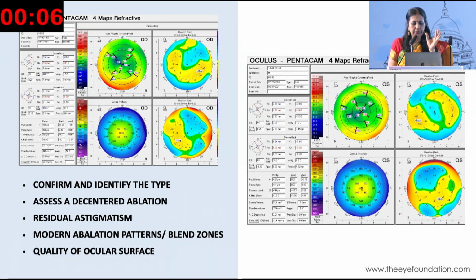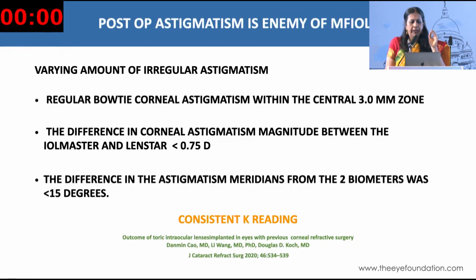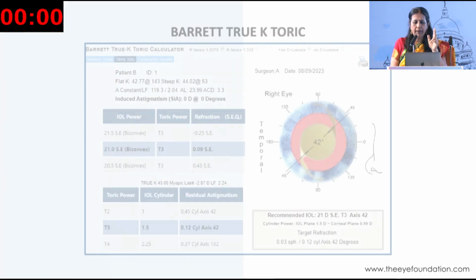Look at that 3 millimeters. Is it a decentered ablation? Then no multifocal. Is it the residual astigmatism? Is it irregular? Look at the ablation pattern. Look at the ocular surface. Look at the eye trace, whether the corneal aberrations are more or the internal aberrations are more. And is there irregular astigmatism? If the two biometers, IOLMaster and LENSTAR, are differing, if the difference in astigmatic meridian between the two biometers is off, then go back and repeat your measurements.